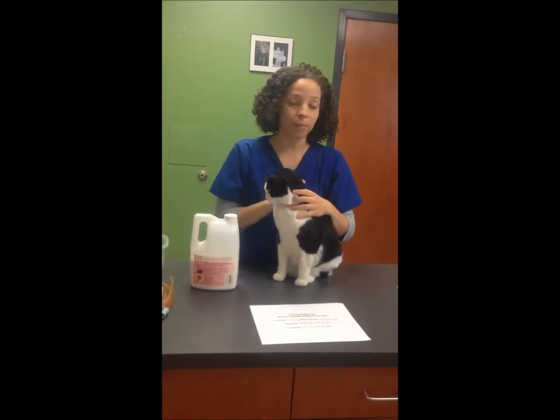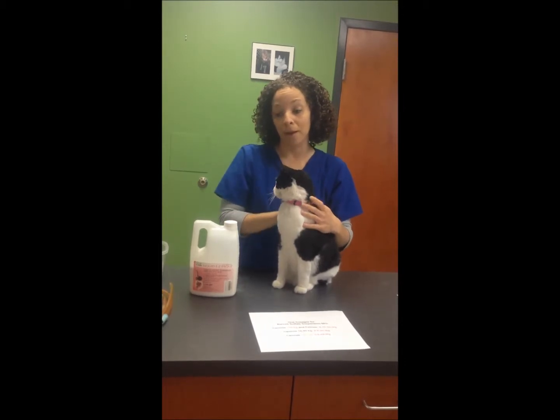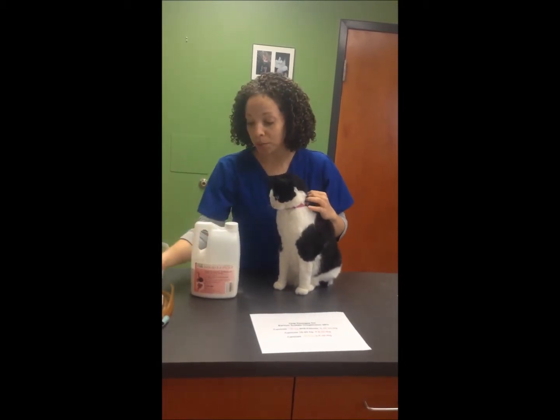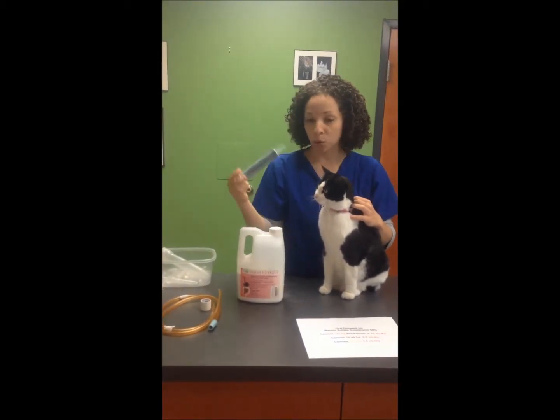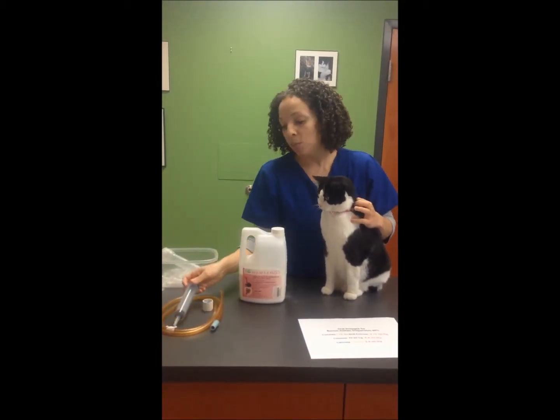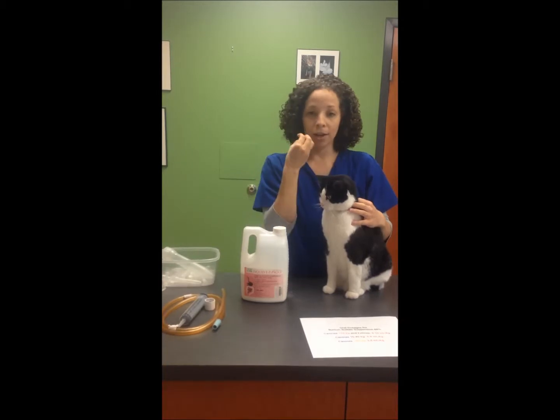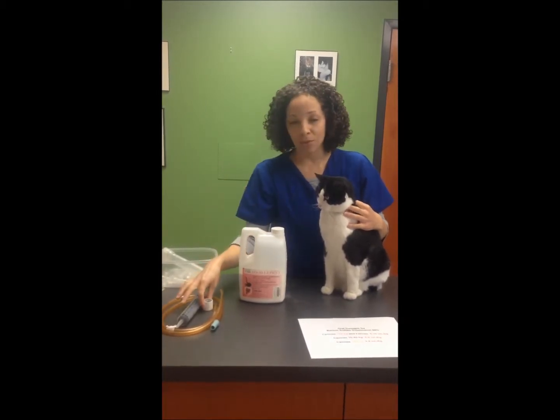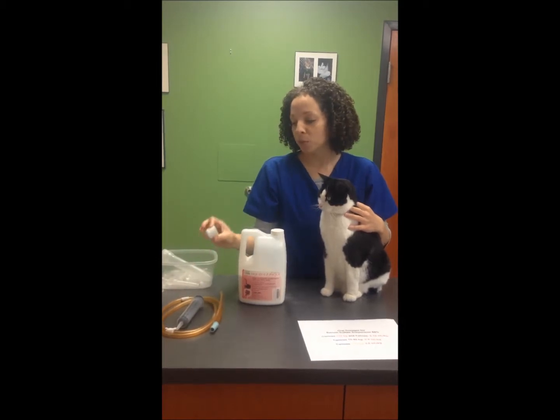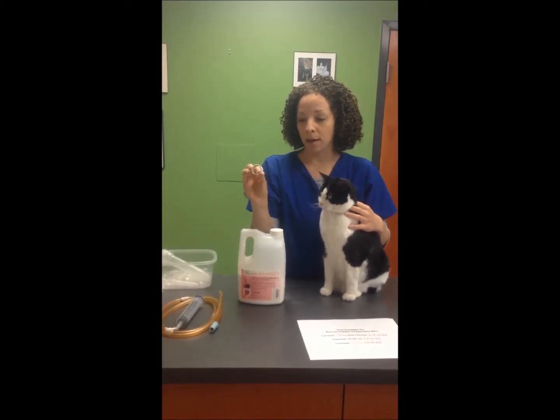So her dose is going to be somewhere between 40 to 45 milliliters by mouth, which we are going to administer to her. We have our 60 cc syringe, which we'll draw up our barium with, and we can either give that directly in her buccal pouch, if she'll tolerate it. We don't actually have an oral speculum here, but sometimes we rig one up using tape.